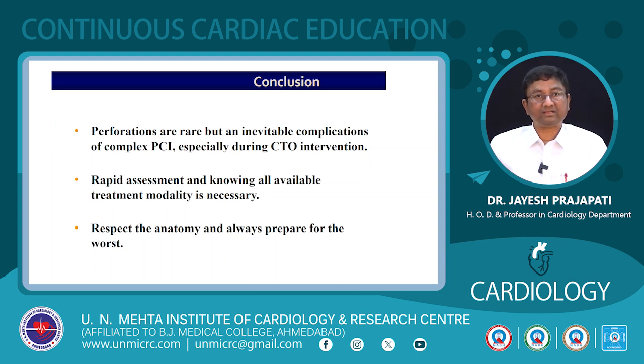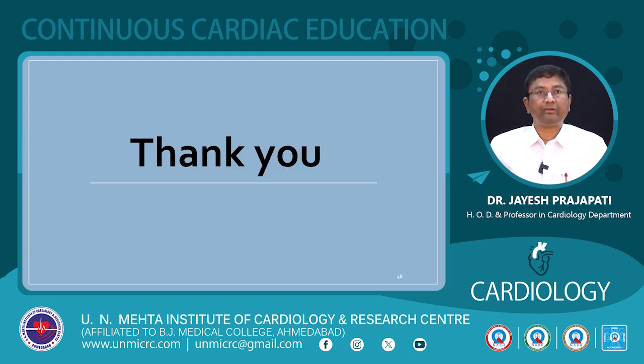So prepare for the worst and always keep all kinds of devices like perfusion balloon or covered stent or microcoils or gel foam particles. Make everything handy and always ask for help. Never think that you are the boss. Always ask for help. Whenever there is an emergency, call the anesthetist, surgeons, or your colleagues inside the lab to tackle things, and you can always give a better outcome to your patients. Thank you. Thank you so much.